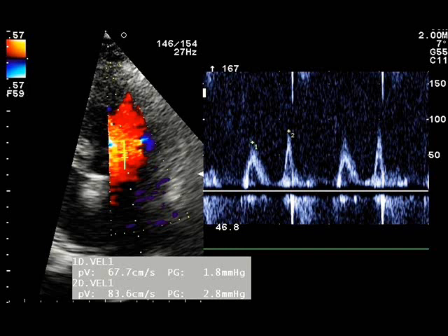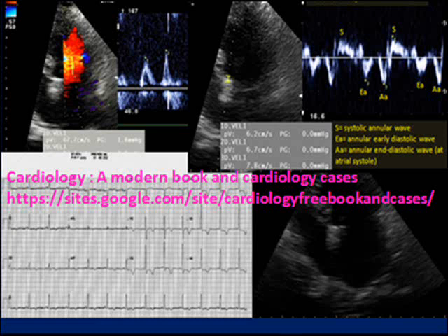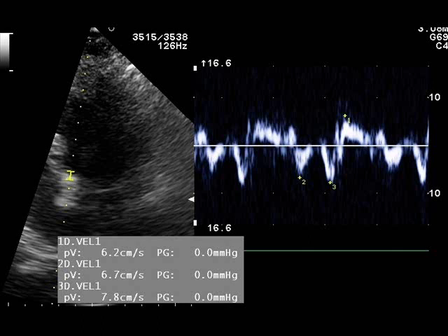In this case, the mitral flow E velocity is 67 cm/s. The corresponding velocity Ea of the septal mitral annulus is 6.7 cm/s, and so the ratio E/Ea is 10. This value for the septal mitral annulus is considered borderline and does not allow a prediction about the presence or absence of elevated left ventricular diastolic pressure. When this ratio at the septal annulus is over 15, or at the lateral annulus over 10, it is usually indicative of elevated left ventricular diastolic pressure and elevated mean pulmonary capillary wedge pressure.